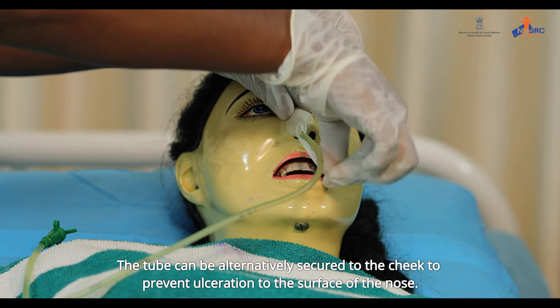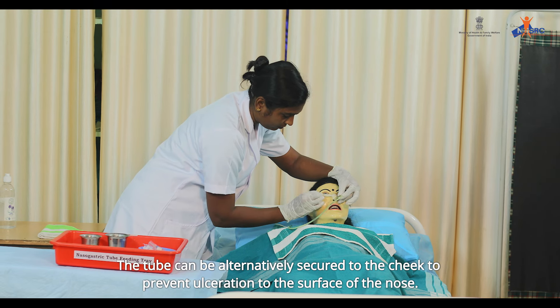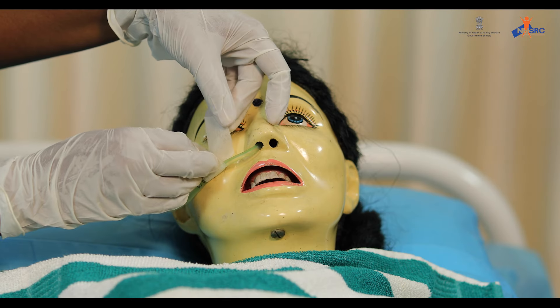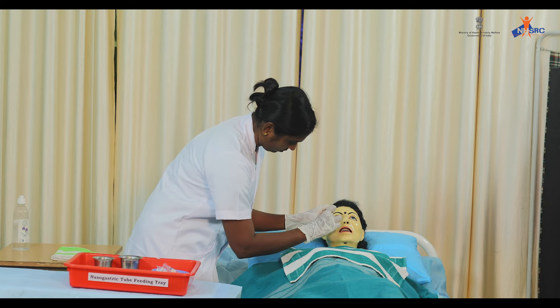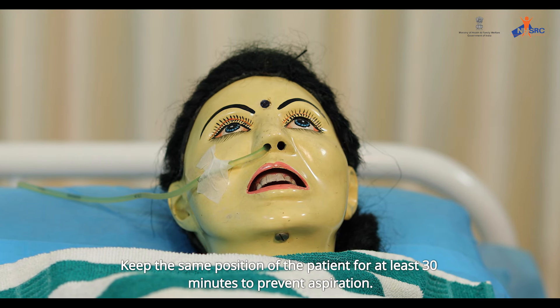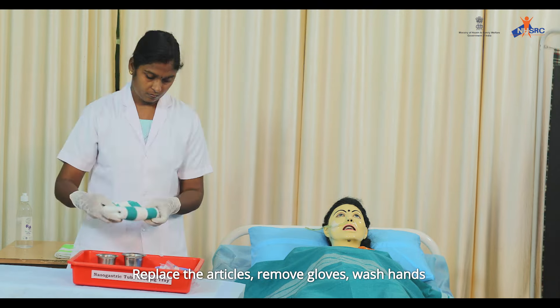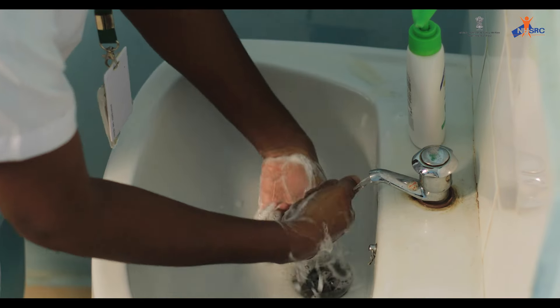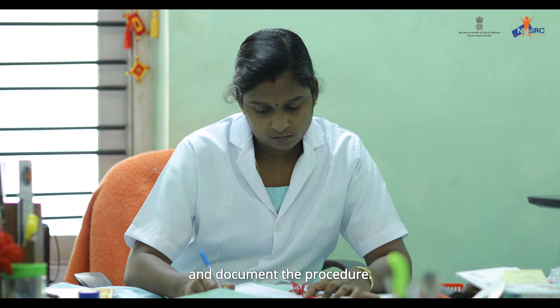Remove the barrel and close the end of the feeding tube. The tube can be alternatively secured to the cheek to prevent ulceration to the surface of the nose. Keep the same position of the patient for at least 30 minutes to prevent aspiration. Replace the articles, remove gloves, wash hands, and document the procedure.